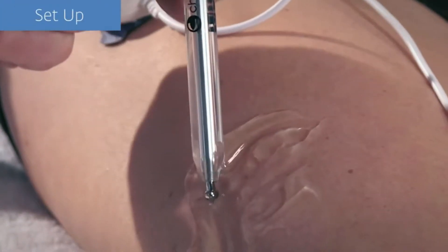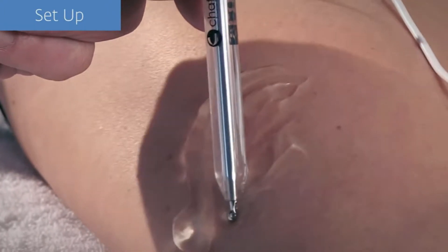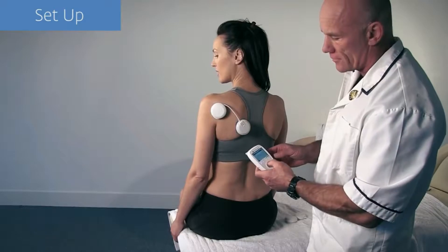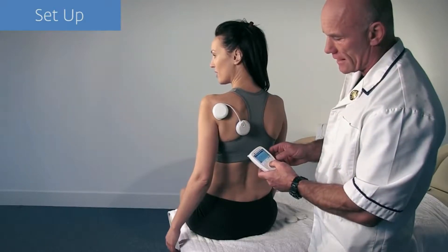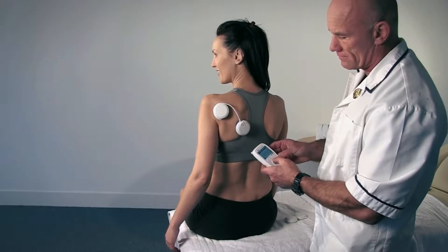The Wireless Professional's motor point pen is the perfect tool for establishing the patency of motor nerves as well as locating the ideal placement for the electrodes. However, for the smaller muscle groups, assessing the physiological movement is an alternative.